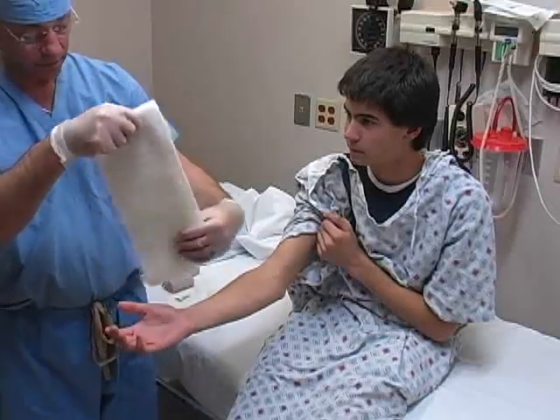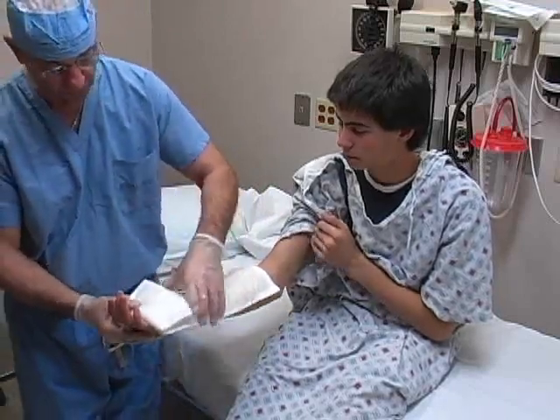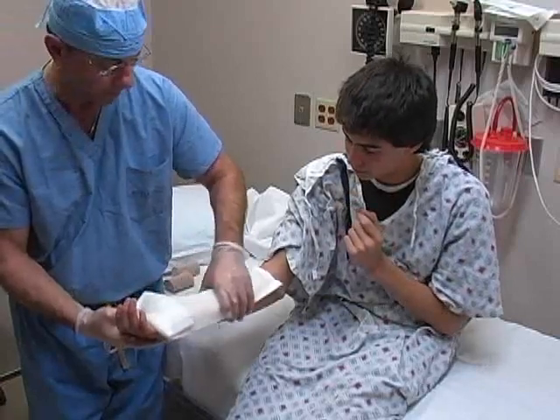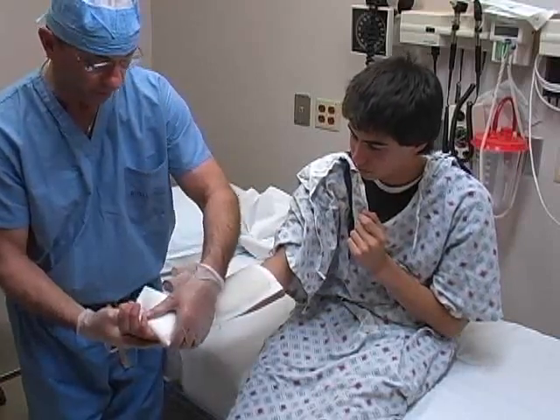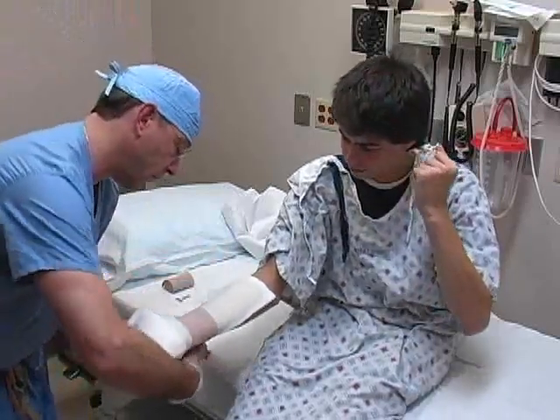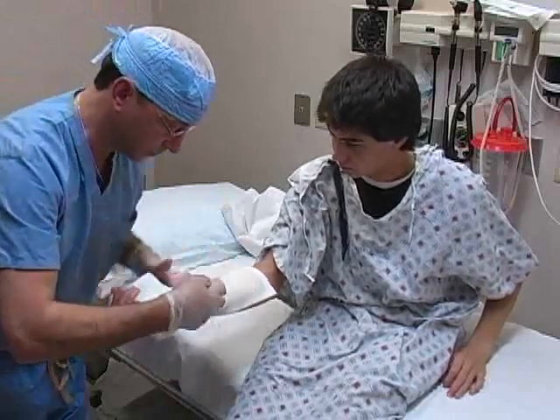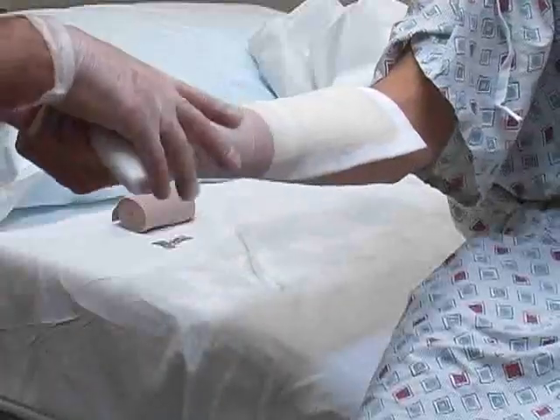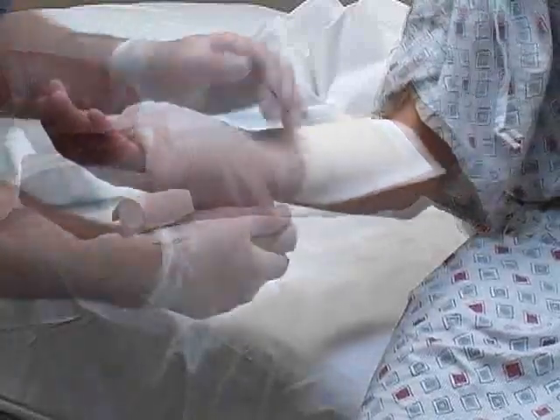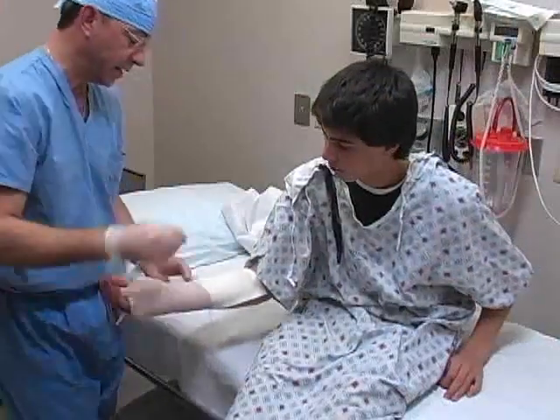Apply the splint. If necessary, fold any excess length of the splint back on itself. Gently mold the fiberglass to the extremity using the palms of your hands. Next, begin to roll an elastic bandage around the splint. In general, wrapping should proceed in a distal to proximal direction. However, it may be necessary to begin toward the center of the splint to secure it if assistance is not available. Overlap each wrap by 50% and apply a modest degree of tension to the roll as you progress.